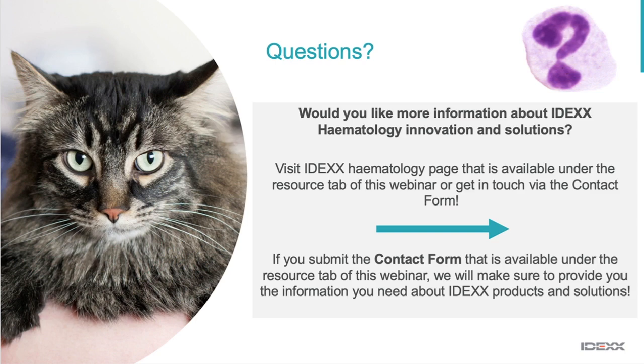That's a great question. Remember, whether you use a reference lab or you use your in-clinic system, you're going to get good results. But there are going to be some slight differences because of the methodologies being very slightly different, at least within the IDEXX system. If you use a different lab that uses a different technology than what your in-clinic system is, then you're going to see even greater differences. And then I didn't even speak about the possibility that things change with time.